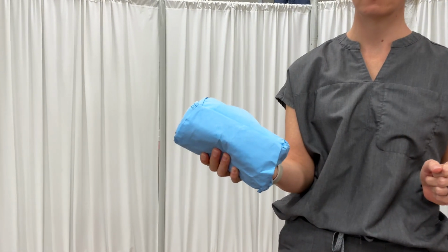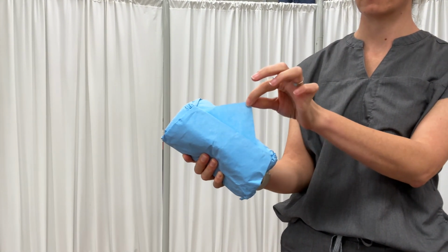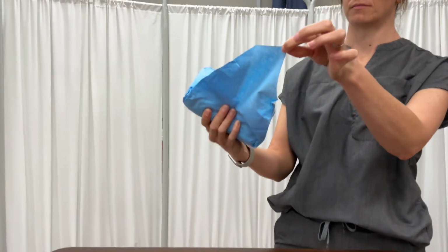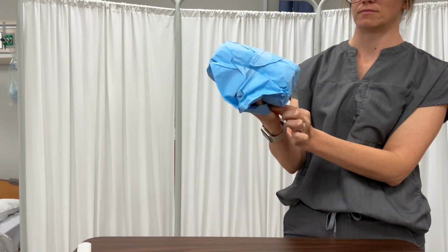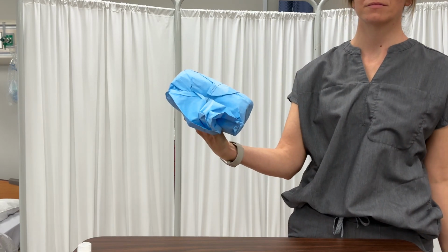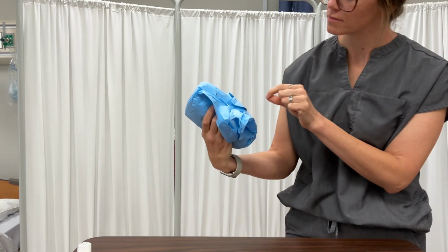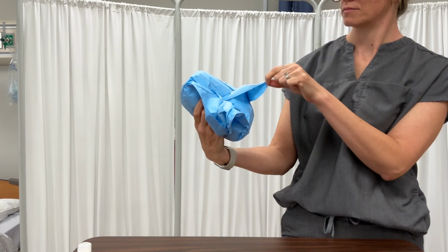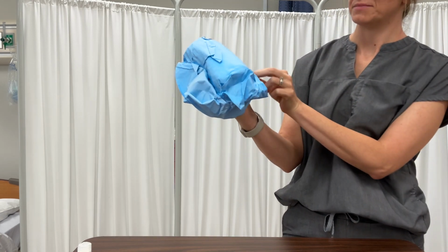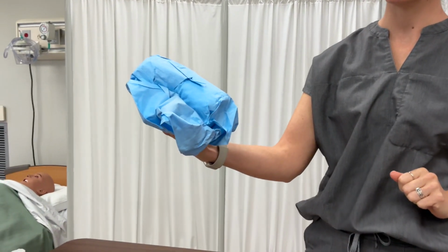So what she's going to do is she's going to carefully peel the wrapper back in the non-dominant hand in the following manner. She's going to open the first flap away from her and transfer the paper to the non-dominant hand while holding the sponges. She's going to repeat opening the remaining flaps as they become available away from the midline, making sure not to cross the sterile field. And again, make sure she has in there that tucking 1-inch border, okay?